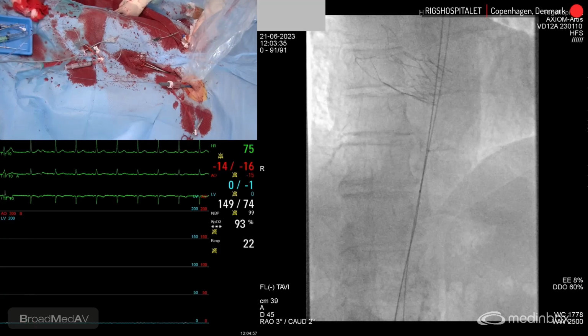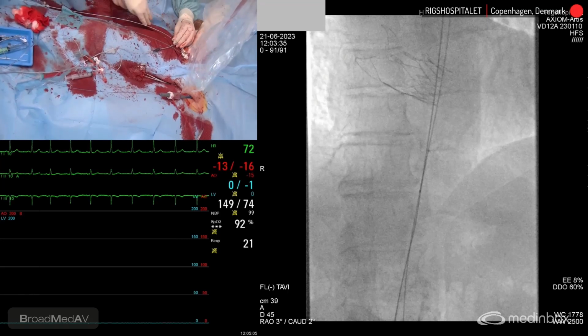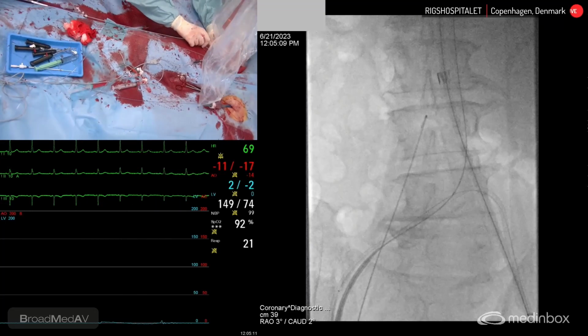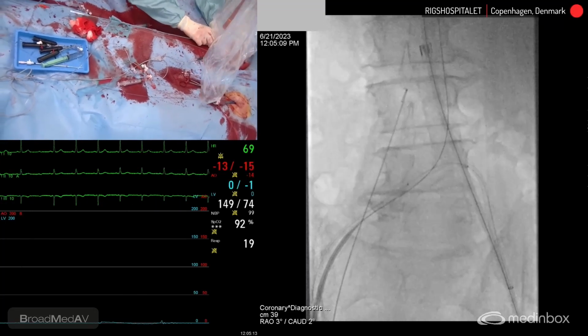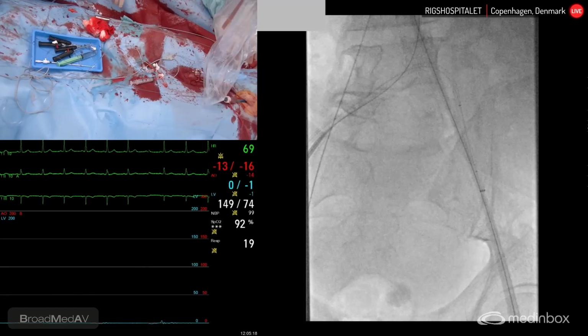Yeah. Just evaluation, everything went fine. We're probably finished in 5 minutes. And that's it. All right, let's park it in the top of the aorta. Yeah, please. All right. More than enough. That's good.